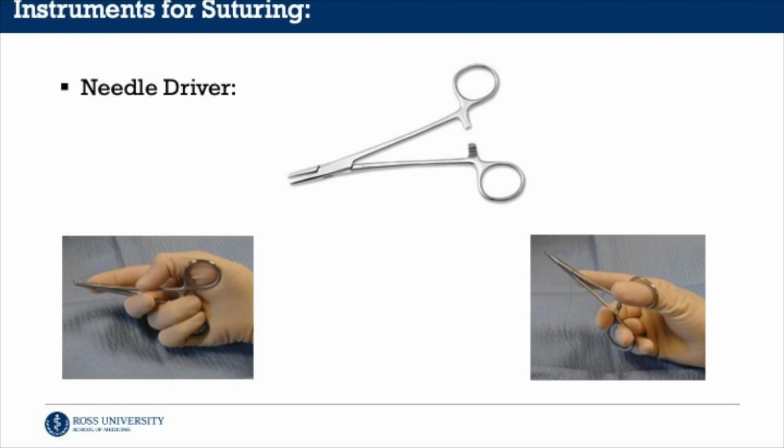You could also use the thumb and ring technique. This is where you hold the needle driver with the thumb and the ring of the needle driver, but your third, fourth, and fifth digits are used to palm the other ring. Your index finger is pointed along the length of the needle driver and rests at the fulcrum, much like that described in the palming technique. No fingers are inserted in the other ring.